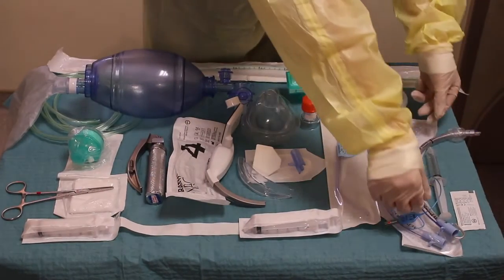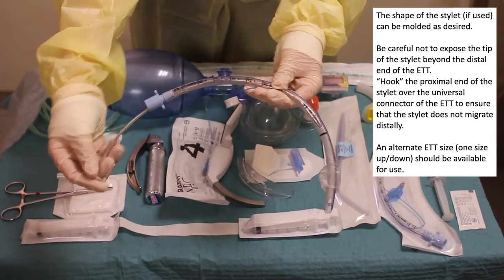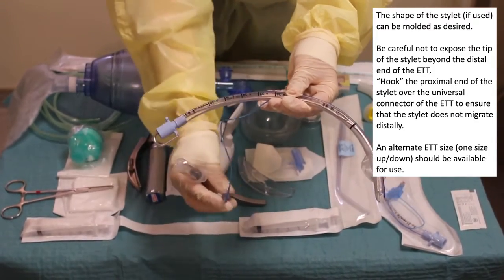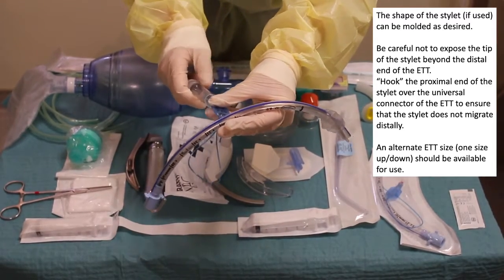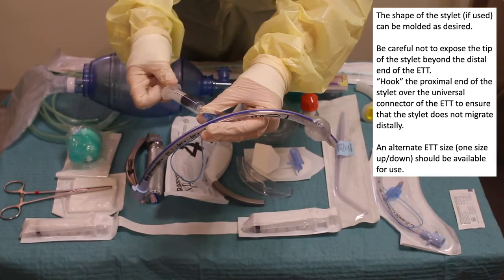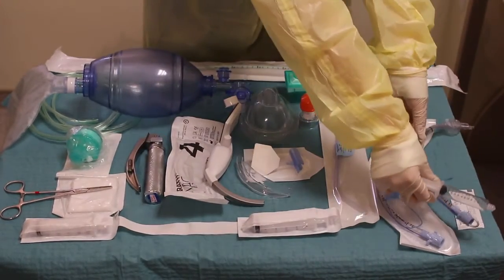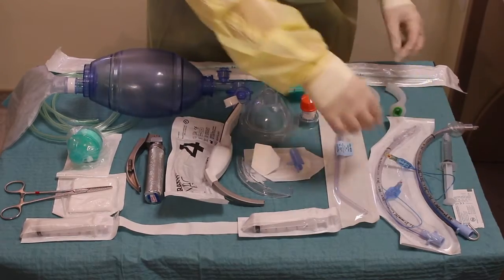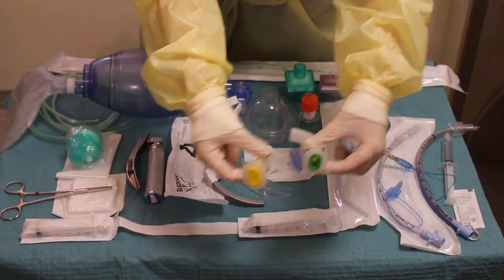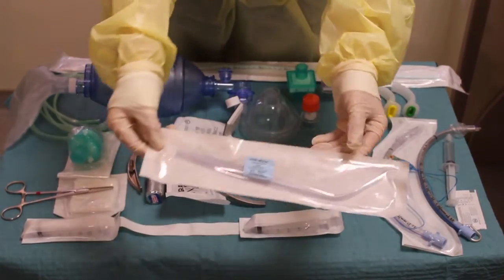So we go through the equipment we have prepared. Firstly is the ETT. Make sure that the stylet is well fitted and that the stylet and ETT have been lubricated. Also make sure that the cuff of the ETT is working. We usually prepare another size for the ETT tube as well. Next is the oral airway — here is the size 3 and size 4 oral airways. And very important is suctioning equipment. Here we are showing the Yankauer suction.